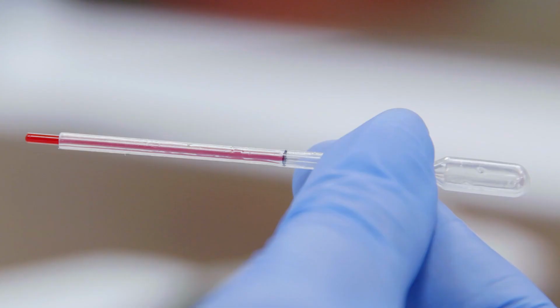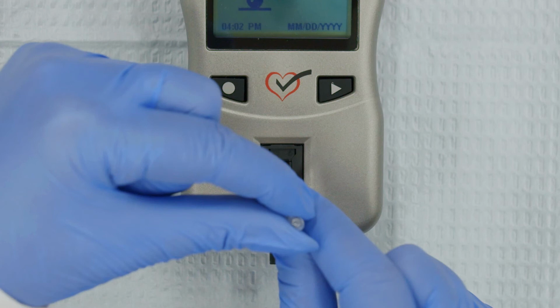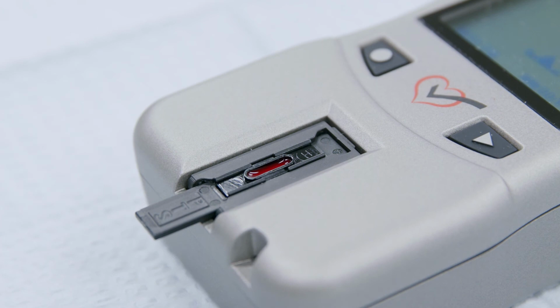To dispense the blood sample, hold the bulb of the capillary tube, placing your fingers over the 2 small holes. In one gentle, steady squeeze of the bulb, dispense the entire sample onto the strip. Be careful not to touch the tip of the capillary tube to the test strip. Once you've applied the sample, do not move the analyzer until the test is complete.